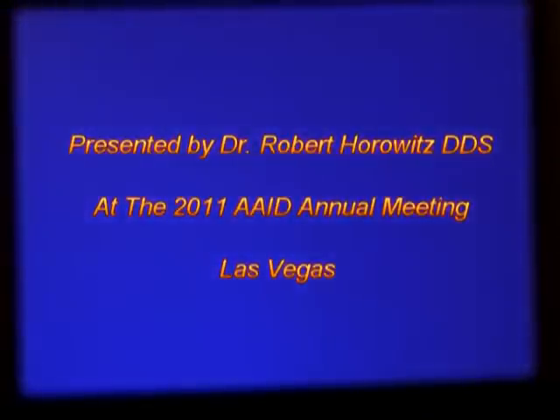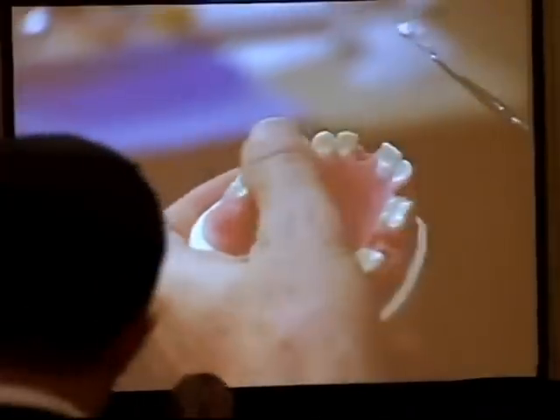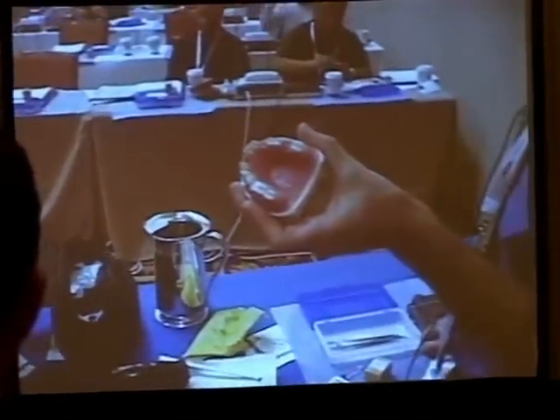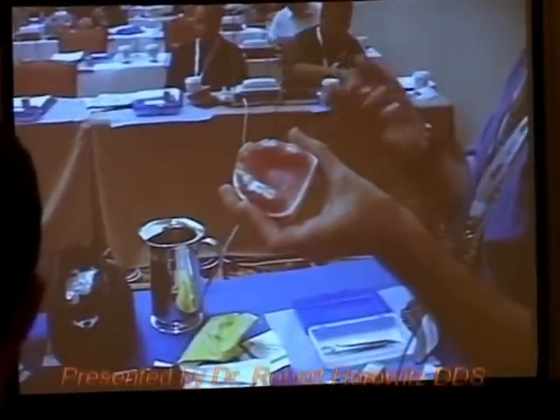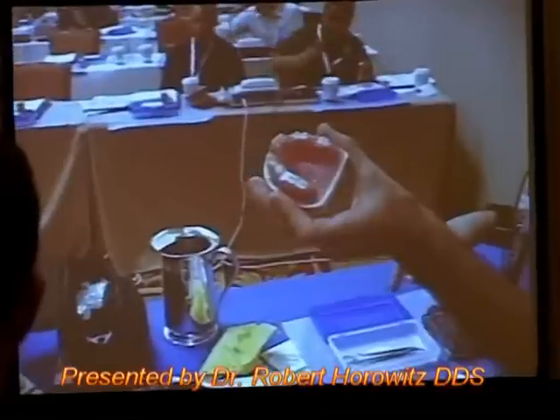Use your spatula and carve it down to approximately a half a millimeter below the level of the gingival margin. The reason you want it slightly below the gingival margin is you want to have room for the body to epithelialize over the top.